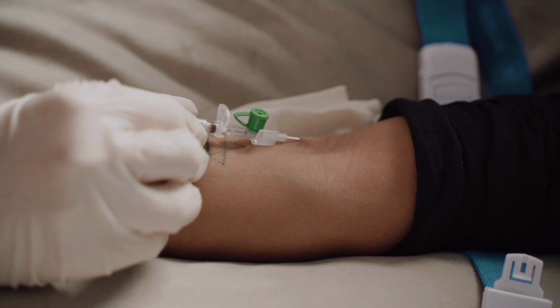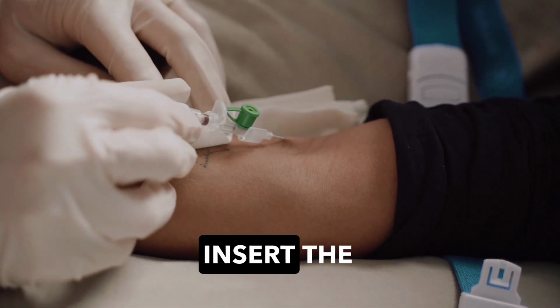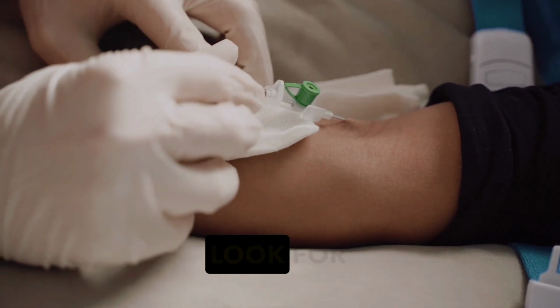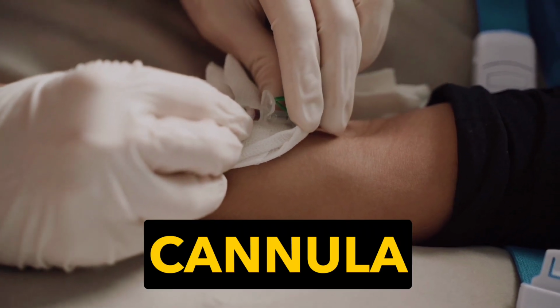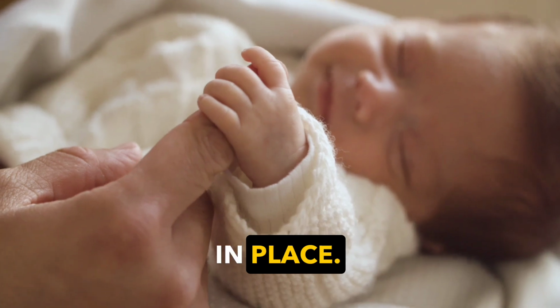4. Stabilize the vein by holding the skin taut. 5. Insert the cannula bevel up at a 10 to 15 degree angle. Look for blood return in the flashback chamber to confirm vein entry. 6. Advance the cannula slightly, then withdraw the needle while leaving the catheter in place.